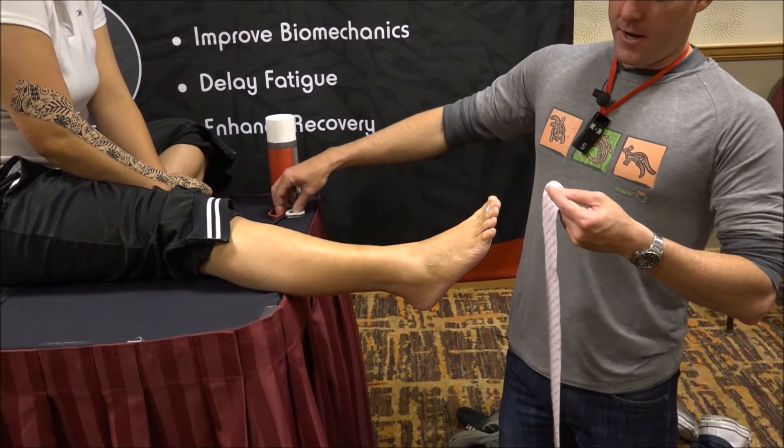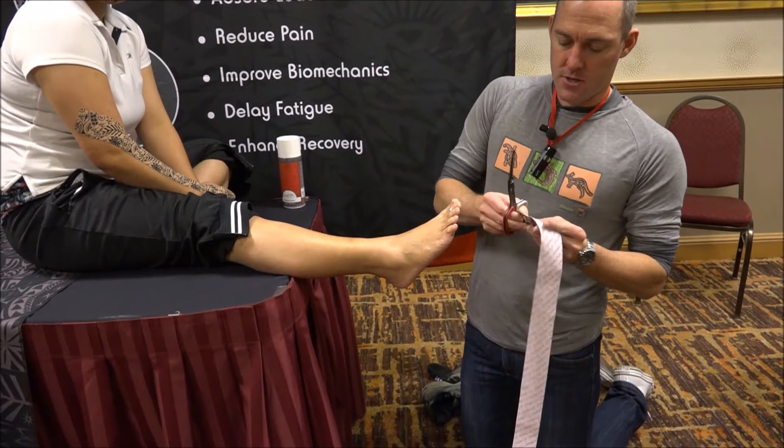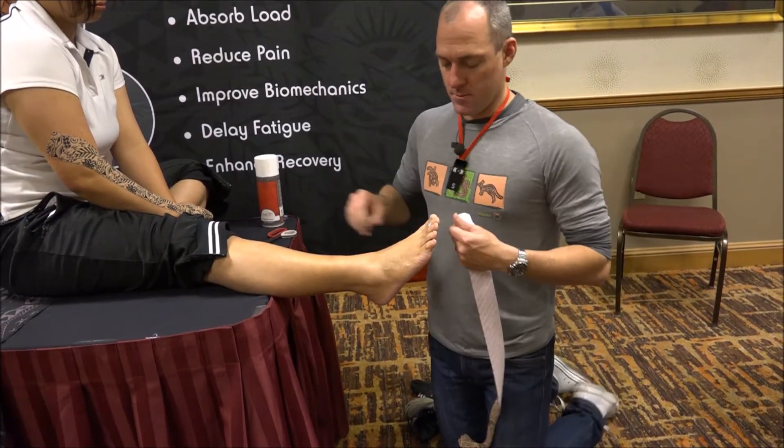At this end, it's not a bad idea just to cut a little wedge out of either side — that just allows it to shape in around your proximal phalanx a little bit better. Just makes it more comfortable, sticks a bit better.